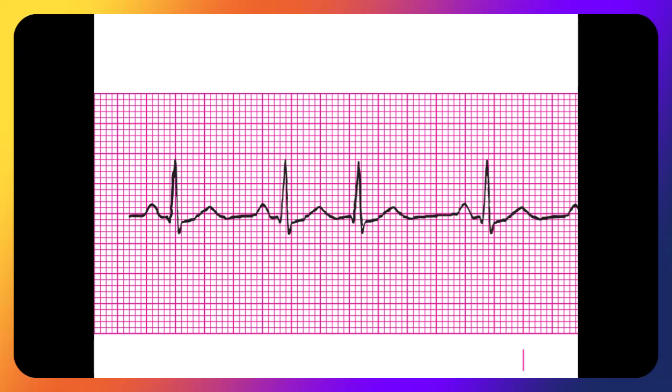Again, as we look at this, look at our P wave right there, and then we come over to this one. Is that our P wave? It could potentially be. Why? Because it could be down on the lower end of the AV junction. This is one of those times when we look at it and agree to disagree. It's okay because we could both be right or we could both be wrong.